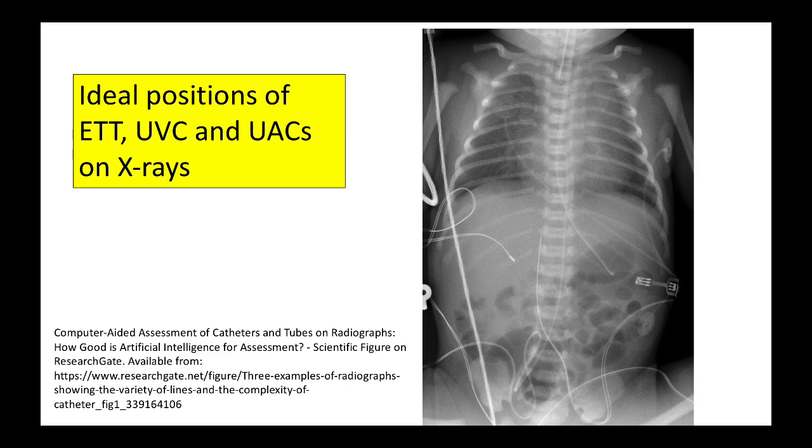I'm Dr. Tala and I've been a neonatologist for over 15 years now, and so far it's been standard of care to use x-rays to check for proper line and tube placement.